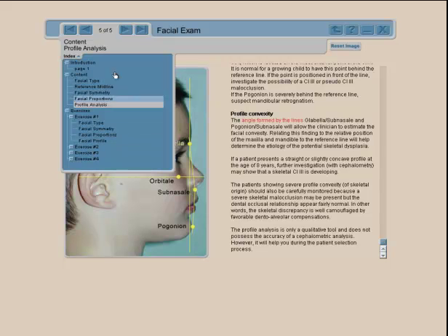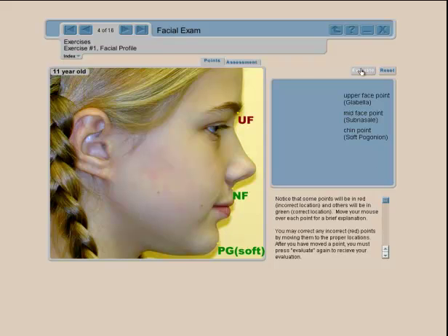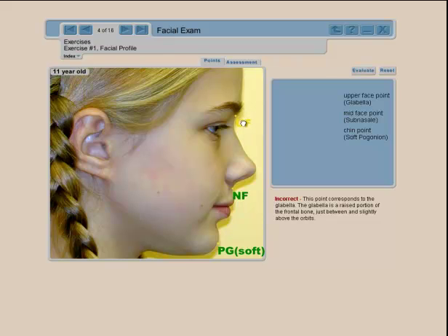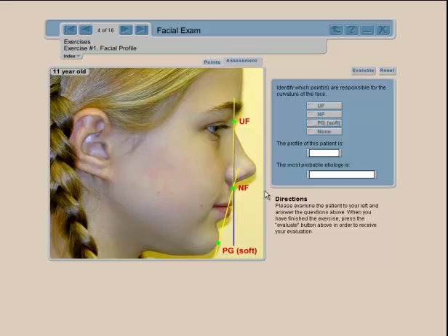When you finish with the content, you can go back to the index, go into facial exam profile analysis, then into the facial profile exercise. Here you are asked to place the landmark points yourself. As long as the point appears red you can keep going, or if you get tired of searching you can go to the assessment and the point will be positioned for you. Then the tracing is done for you.